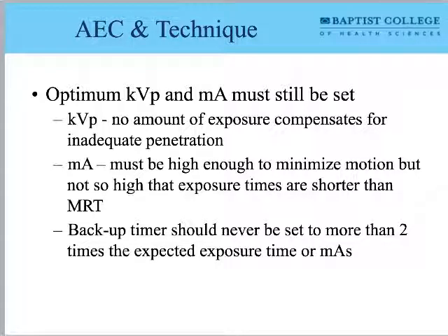The technologists have to go in and manually reset the backup timer. And knowing some of the knuckleheads that y'all work with, they probably didn't do that, right? Like there were egg rolls in the cafeteria that day or something, right?